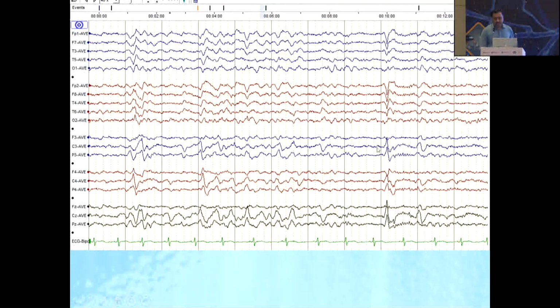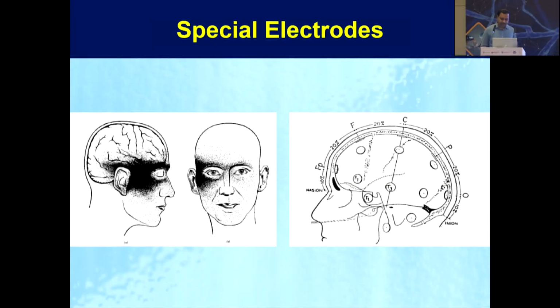If you are experienced, you will be able to see that this is C3 and CZ, so these are the vertex waves. But because the reference has become contaminated, other electrodes are also showing these signals or waveforms. That is why sometimes it's difficult to see in the average montage. It requires a bit of experience when you graduate from the bipolar to the referential montage.